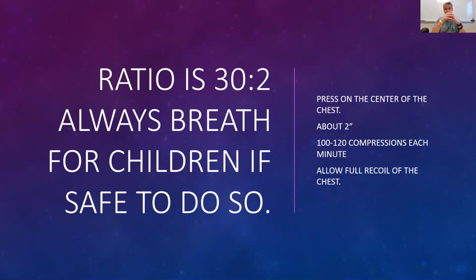So when we think about compressions and why they're so important, that's moving that oxygen supply in the patient's body up to their brain. When the AED comes in, and that stands for automated external defibrillator, that's a device that can actually shock the heart back into its normal rhythm, right? Because ventricular fibrillation needs to be defibrillated. And the device is actually called an automated external defibrillator. So they're great, they're easy to use. I look forward to walking us through that as well.